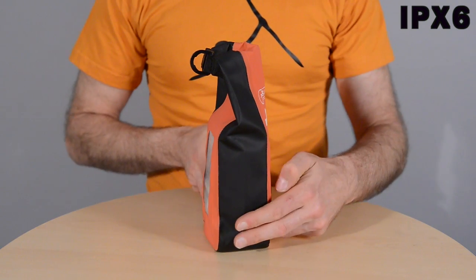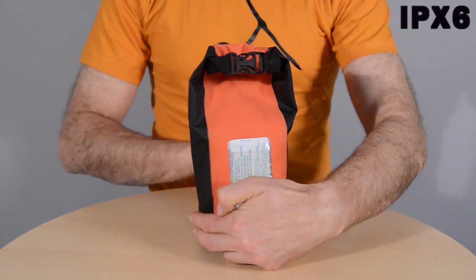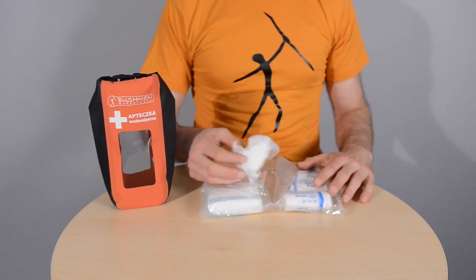This is a waterproof first aid kit. It protects the inside from dust, dirt, and water.